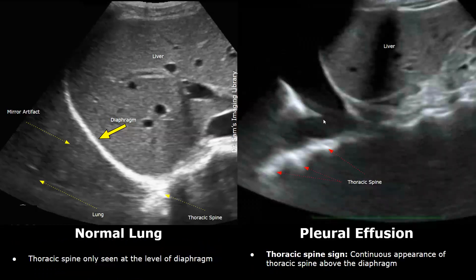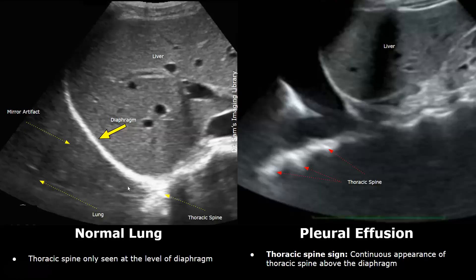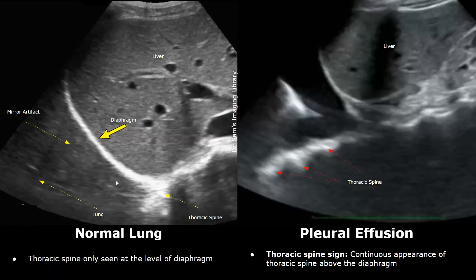There are some specific sonographic signs indicating pleural effusion. The first one is the thoracic spine sign. Normally we will not see the thoracic spine above the level of the diaphragm — this hyperechoic area in the normal image is the thoracic spine, and you cannot see any thoracic spine above the diaphragm. We can only see the air-filled lung. In the image on the right is a case of pleural effusion.